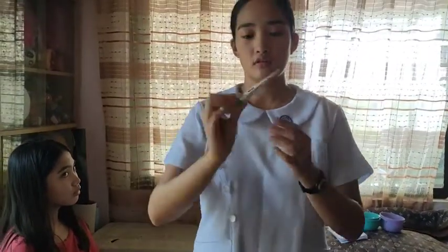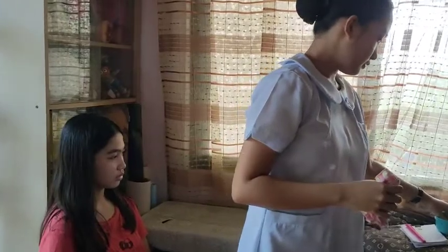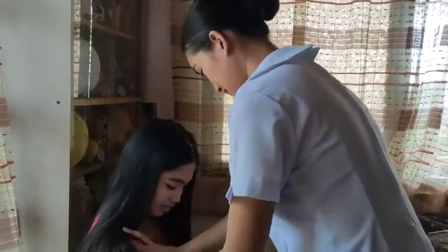After cleaning the thermometer, we will now turn it on, then pat dry the axilla of the patient. We can use dry cotton balls or towels to pat dry the axilla. We need to pat dry because some patients' axillas are sweating, which can interfere with the accurate reading of the temperature.